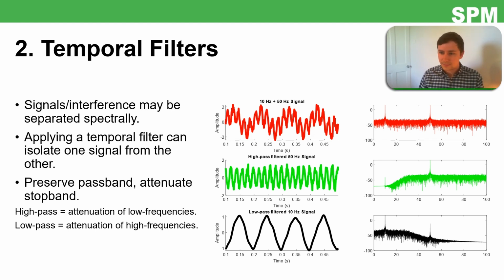And yeah, you can see these are extremely powerful. So in the green, I've just made a high pass filter at 30 Hz. Kind of strange, you would probably never do this, but you can see that it has attenuated those lower frequencies in the spectral domain, and also you can see they're no longer present in the temporal domain, which is brilliant, isolated the signal perfectly.